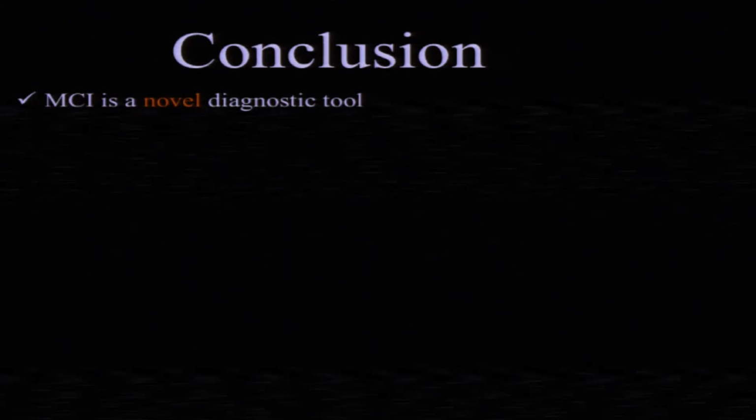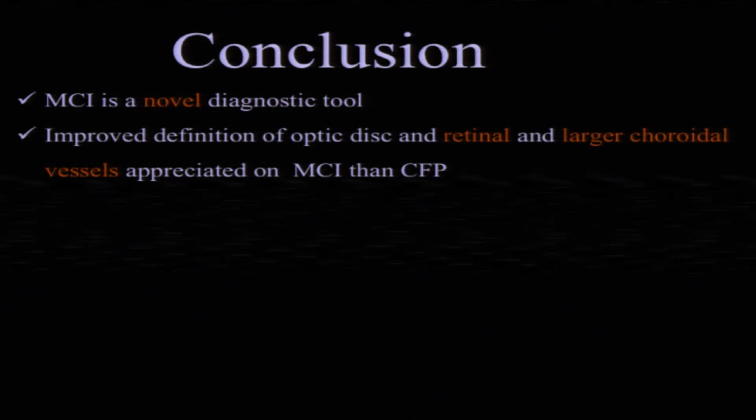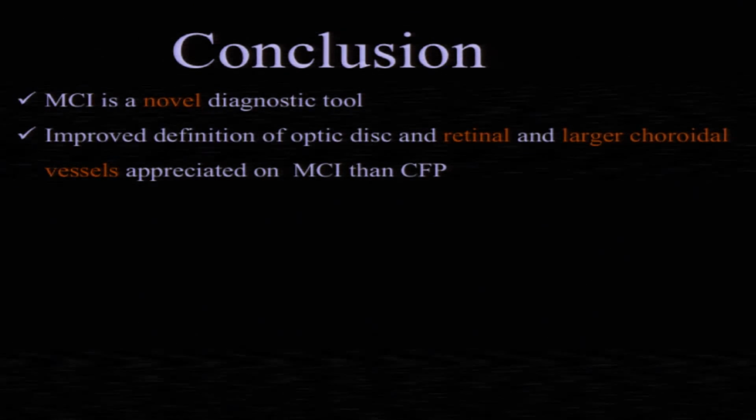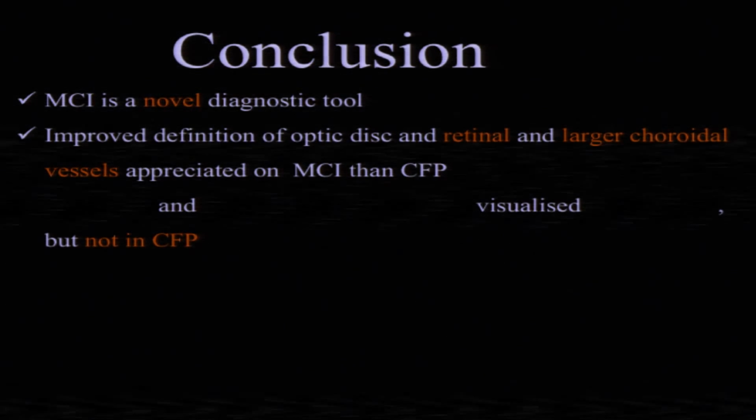I would like to conclude that multicolor imaging is a novel diagnostic tool, with improved definition of retinal and larger choroidal vessels. ILM folds and fibrovascular membranes were visualized only in multicolor imaging but not in color fundus photography. However, further studies need to validate the various details seen in multicolor imaging with other imaging modalities. To the best of our knowledge, this is the first study reported on multicolor imaging in posterior uveitis. Thank you for your attention.